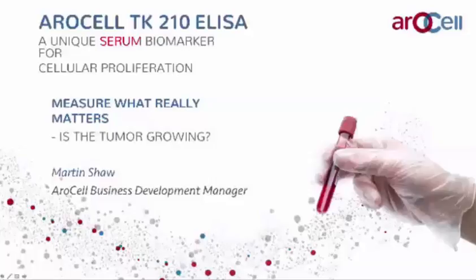All right. Our next question, what about TK1 and other biomarkers in prostate cancer? Okay, this is also a good question. Of course, in prostate cancer, the most used and most famous biomarker is the PSA, prostate-specific antigen. But I will say that TK is used now, and we are inquiring about how to use it in combination with PSA.